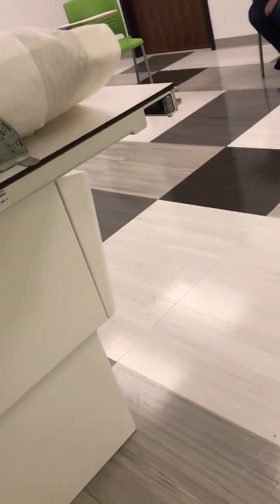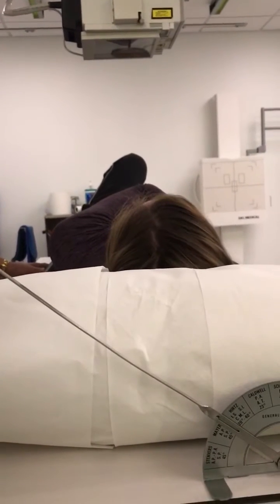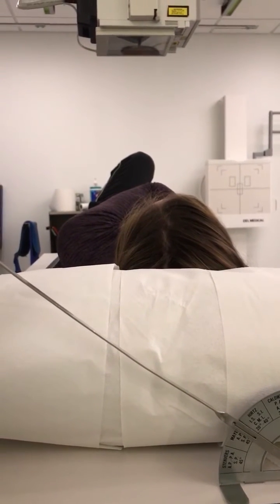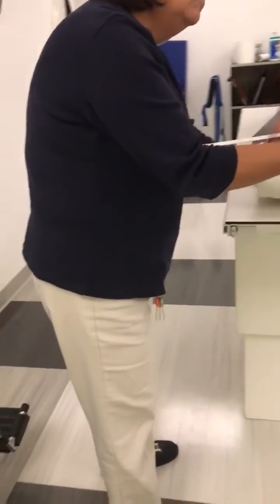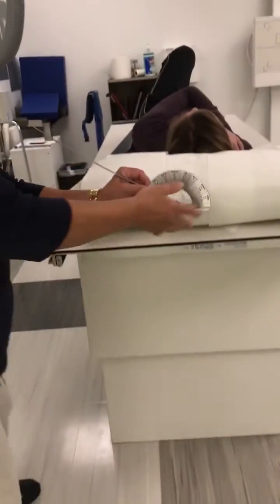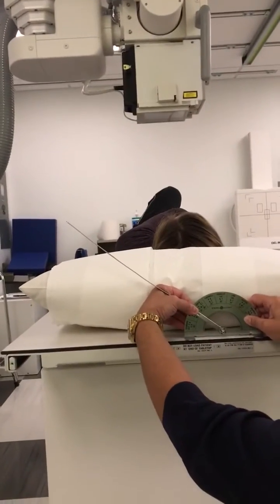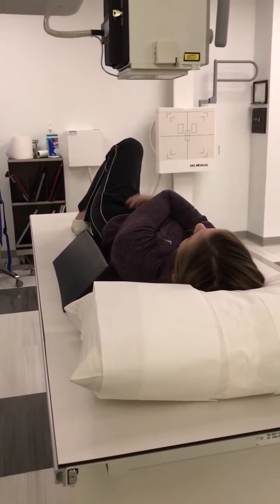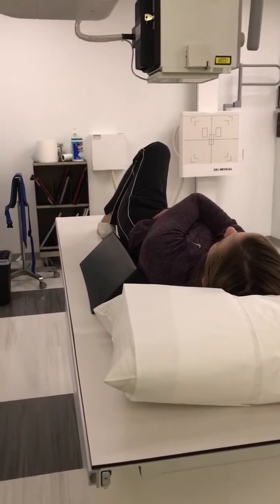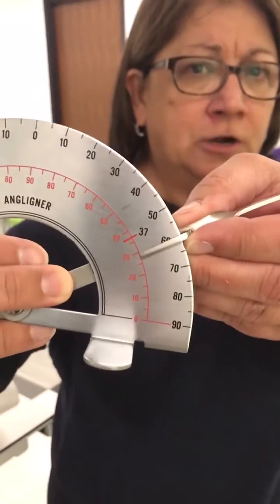So how do I adjust that? Very easily. I'm just going to pull the sponge out from behind you. It allows her to go a little flatter. So we keep the sponge there the whole time? Yep. You do keep the sponge there. I think that's good. Correct. So you wouldn't use this during your simulation, but when you practice, use this. See the 30-degree mark on that instrument, the goniometer.